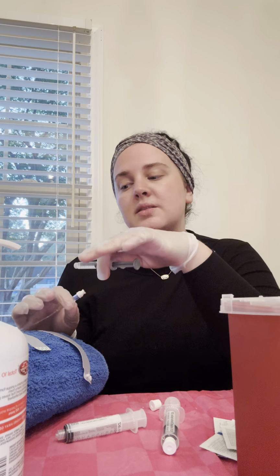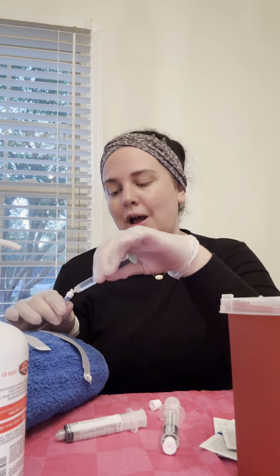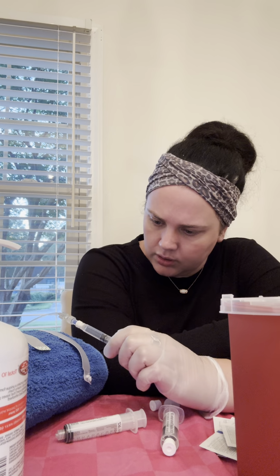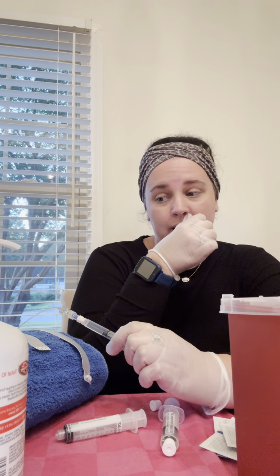And at this point, since this medication is administered over 2 minutes, I would explain to the patient, hey, this is going to take 2 minutes. I'll be right here pushing this medication. I'll go ahead and go. So we're going to be doing 0.5 every 30 seconds is what our goal is going to be. And I'm just going to keep an eye on this line just to make sure nothing crazy happens or infiltrates. And also just communicating with the patient since I am going to be here for 2 minutes.